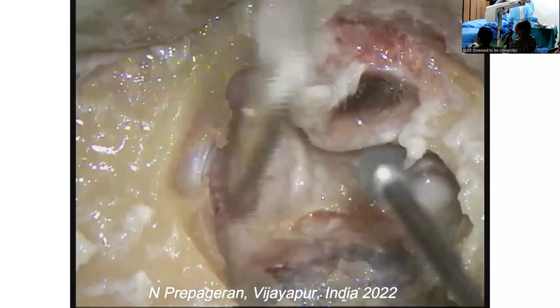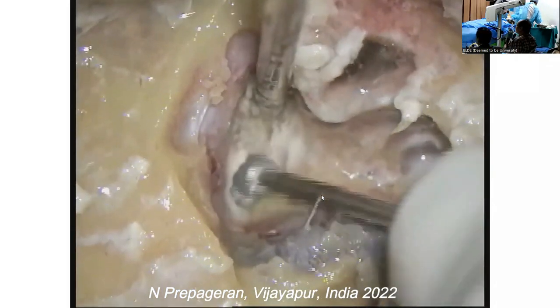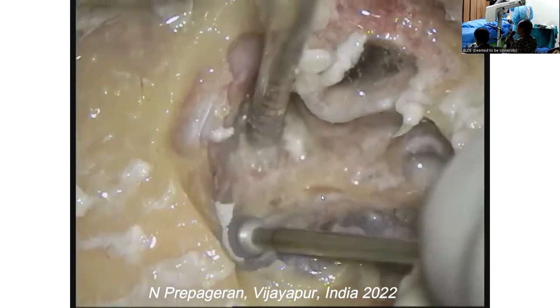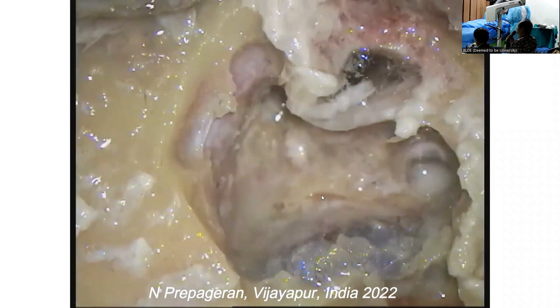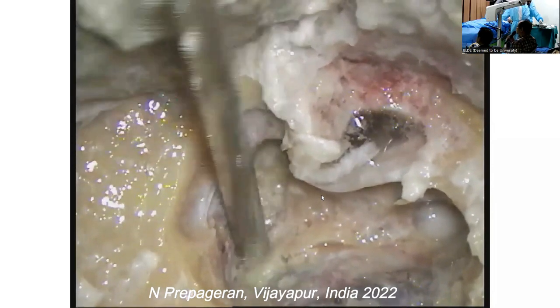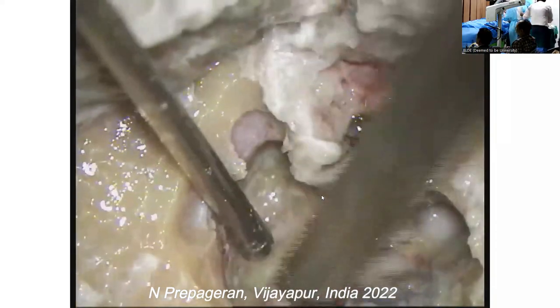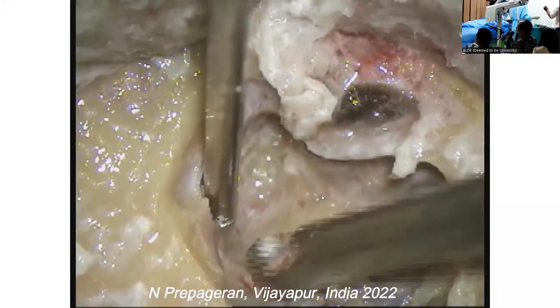Like I said, I give the exposure purely based on where the tumor is. There you go. Sinodural angle coming into view. New glove, guys. My glove got stuck in there. I need a new pair of gloves as well. Guys, can you see? Sinodural angle. Okay? There.